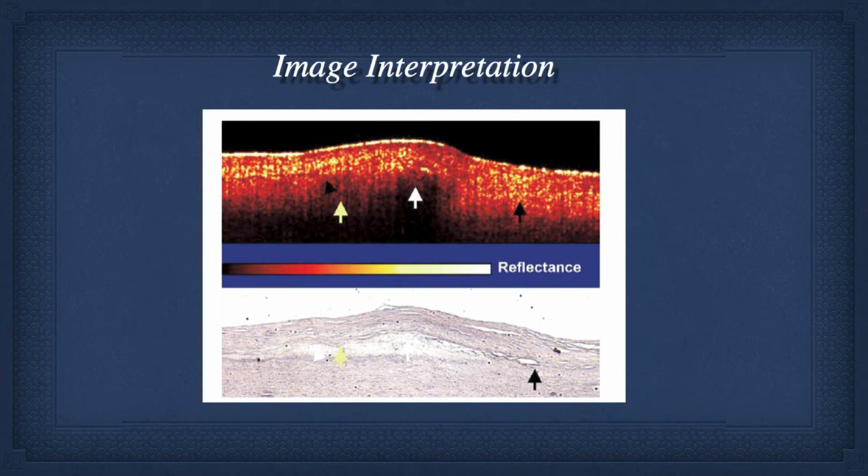And so what's happening here is the diffuseness isn't coming from the core. The diffuseness is coming from, if you look above the area at the yellow arrow in the intima, those bright scattering, yellow scattering areas are cholesterol clefts and calcium. And so they lead to high scattering, which leads to a phenomenon known as multiple scattering, which isn't critical for the discussion, but it makes the border diffuse. And if we look on the right, there's not a lot of scattering in the intima, so the border is sharp. The image hasn't been distorted by scattering from the intima.